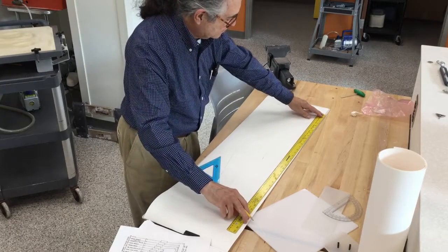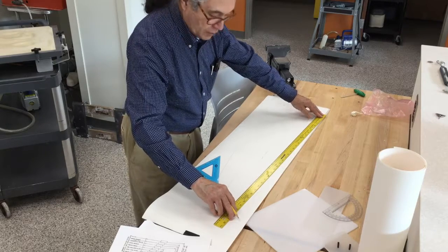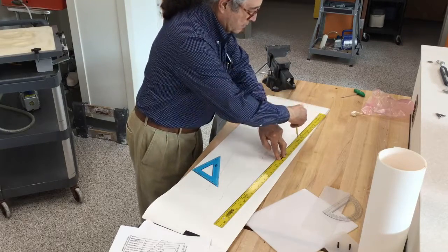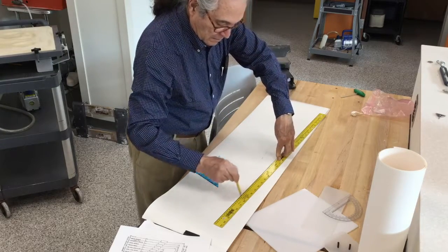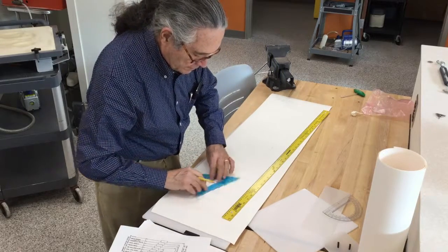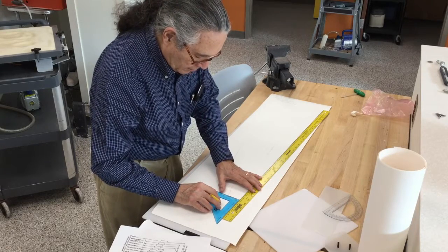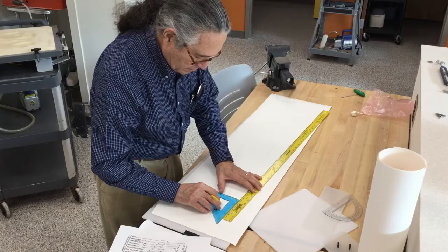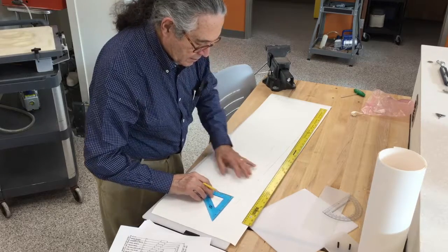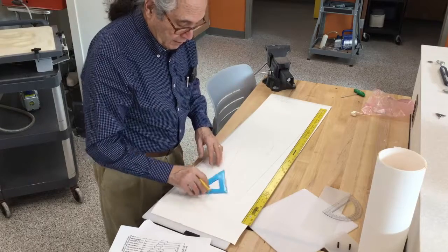Those points rotate, and whichever one it touches first — in this case it's the ankle — that becomes our mid-sagittal line. We can also see our baseline here, and we want to transfer the baseline to the mid-sagittal line. So everything is now worked out from the mid-sagittal line.